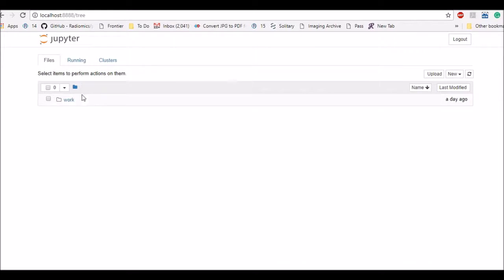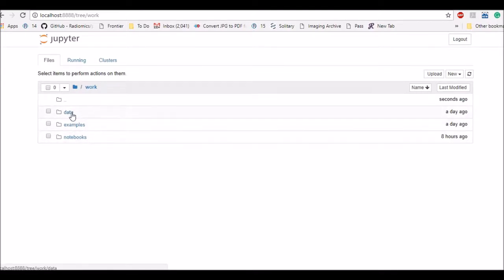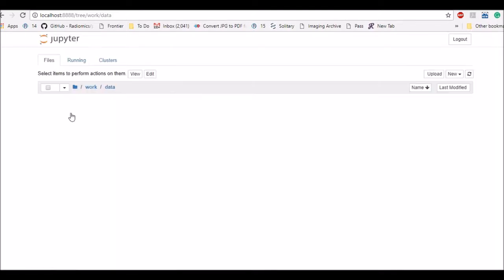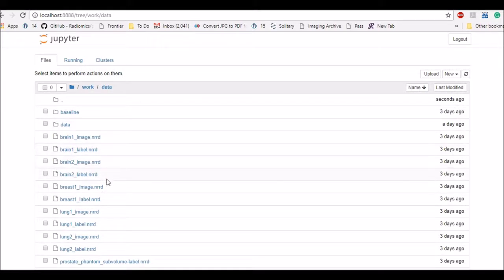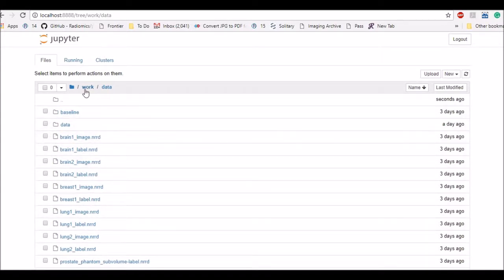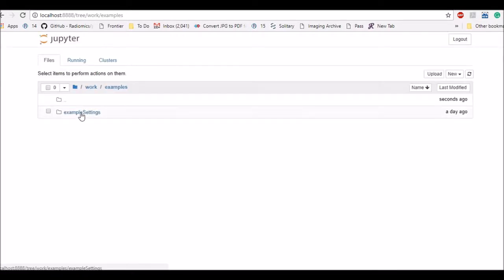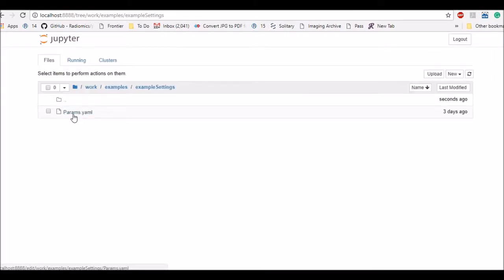And I can browse through the directories here. So starting with the work directory it has three subdirectories: data, examples and notebooks. So in the data directory it has all my images such as brain, lung, breast images. So these are the images which we will be using in the examples today. And going back to other directories, in the examples directory you have the settings specified for the examples and the way settings are used in pyradiomics.